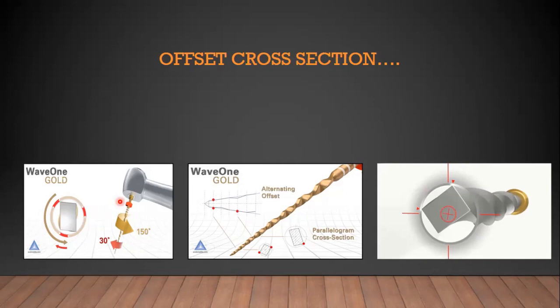It will lead to over-preparation of the apical foramen. It will weaken the root, and there may be apical root cracks. It may lead to taper lock, and when it gets taper lock, more torsional stresses will be generated, which may increase the risk of instrument fracture. So we need to reduce the screwing in forces.